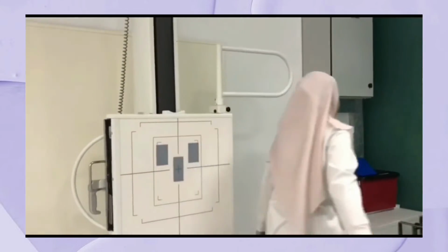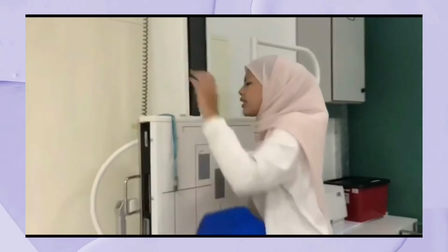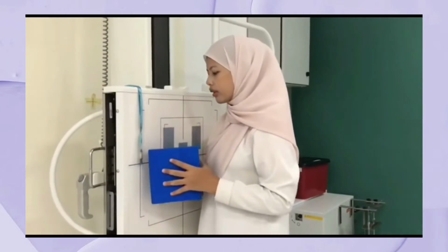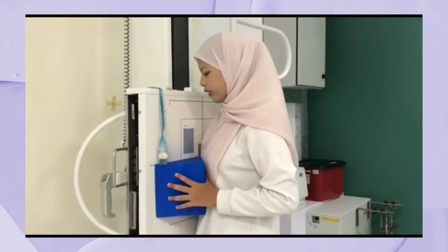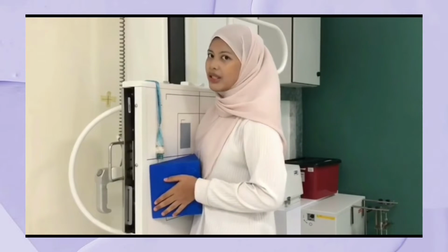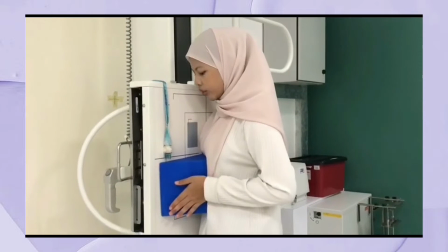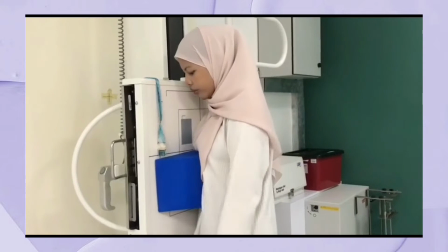Okay. Here, there is a 45-degree sponge. Okay. What's the use of this sponge? This sponge is used in order to make sure your patients don't move when doing an oblique examination. During an oblique examination, your patient's body will have to be rotated 45 degrees. So in order for your patients to stay still, this sponge will help them to not rotate their body. Okay, so there will be 45 degrees.